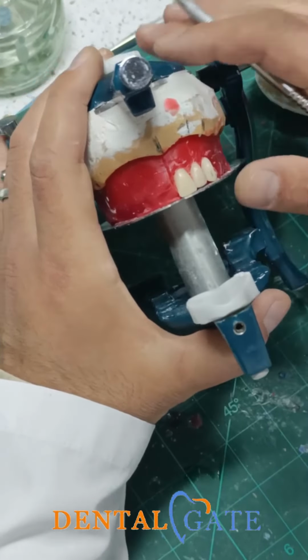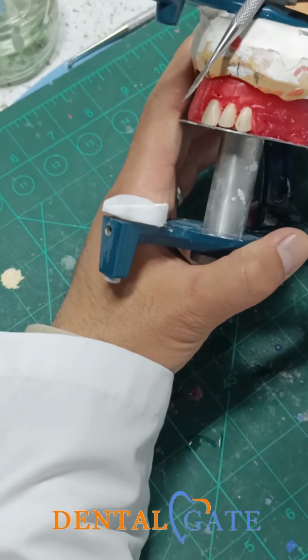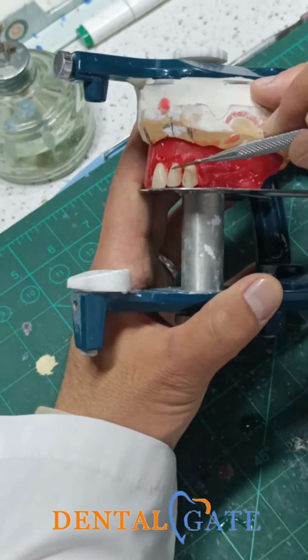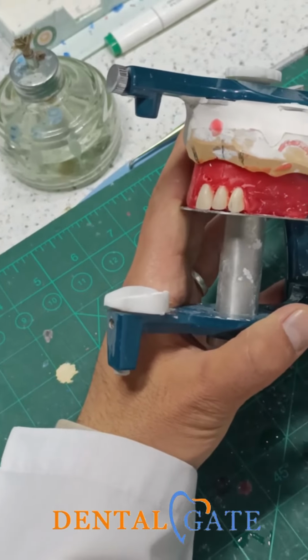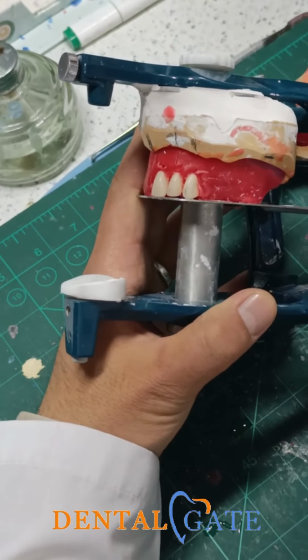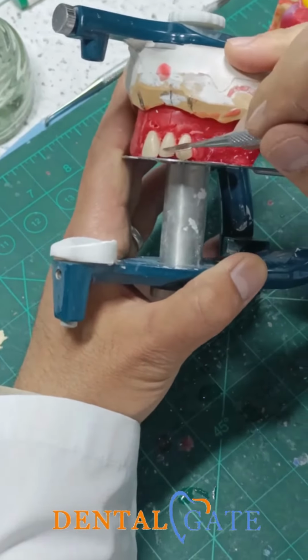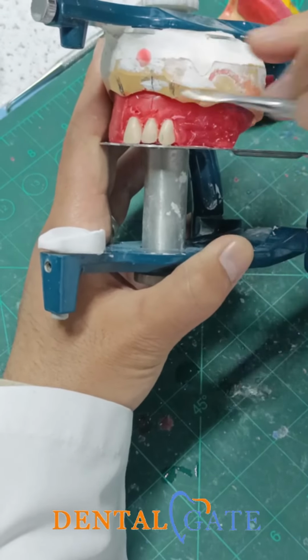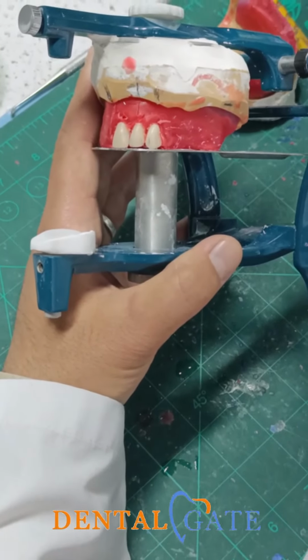The curve of the anterior teeth, you can evaluate from the distal aspect. The central incisor should have a proclination. For the lateral incisor, this area should be prominent. This is regarding the anatomy, not the fundamentals of the arrangement. We already have a severe convexity in the lateral toward the lingual. So naturally, the lateral should not exceed this surface. It should be under this surface. Okay? So you can make the evaluation with the contact area, with the most curvature in the contact area.